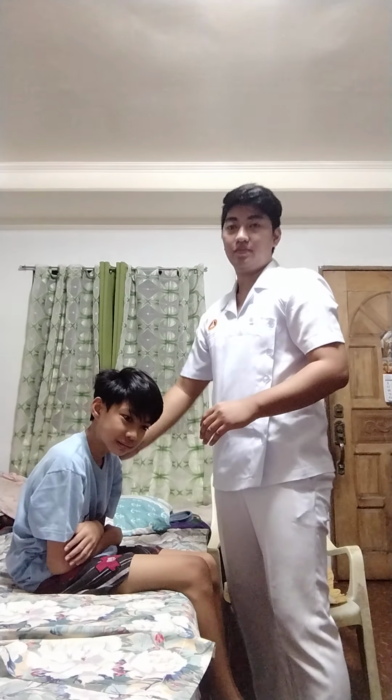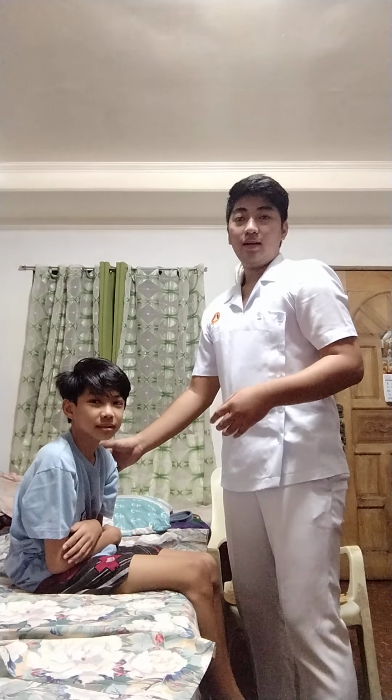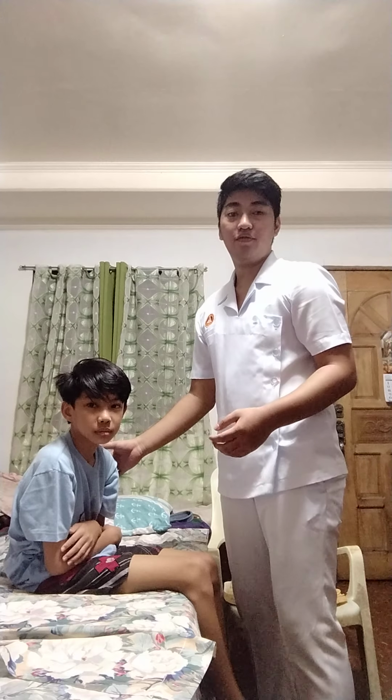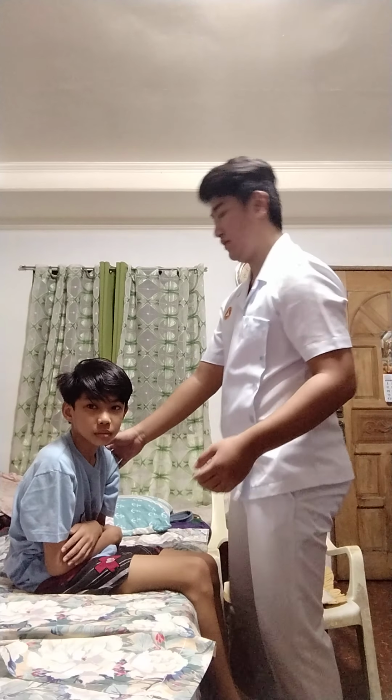So next, wrap the guide belt around the patient's waist based on assessed need and facility policy.